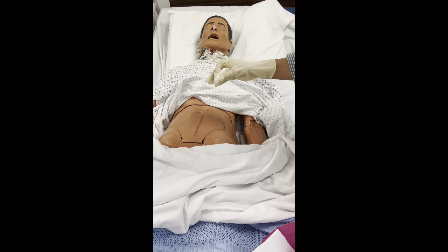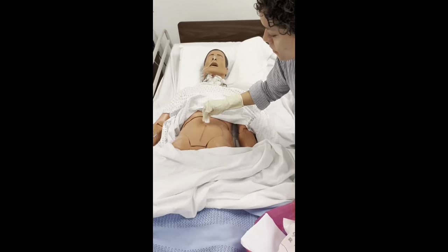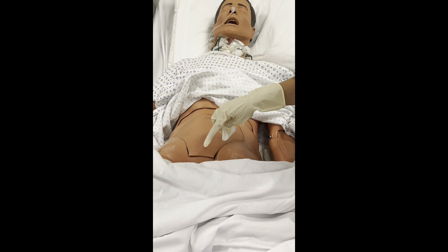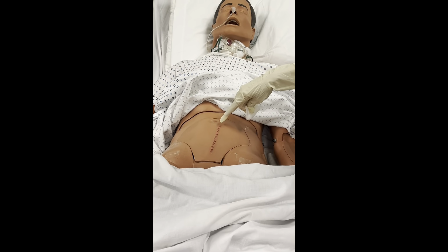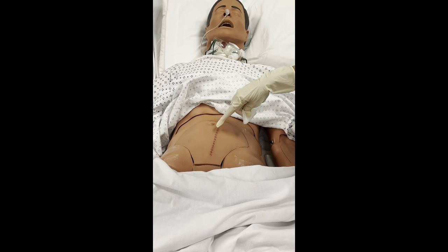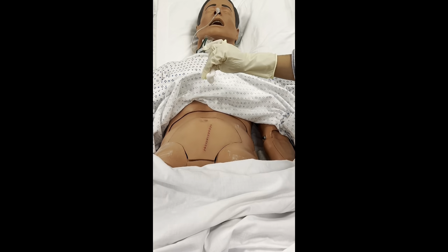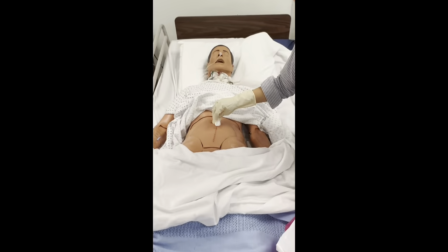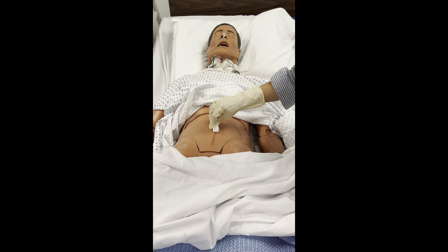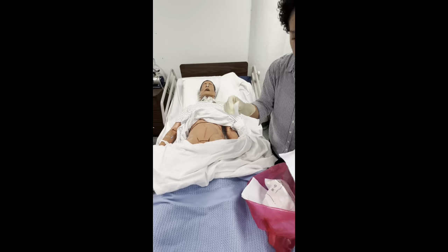So you're going to clean the area 3 times. You start medial, so that's going to be at the center. You want to start from here, from the top of the surgical incision, moving your way downward. It's just one swipe. So I'm going to perform. Okay. And then to the garbage.